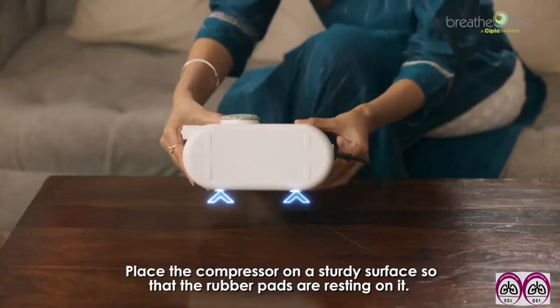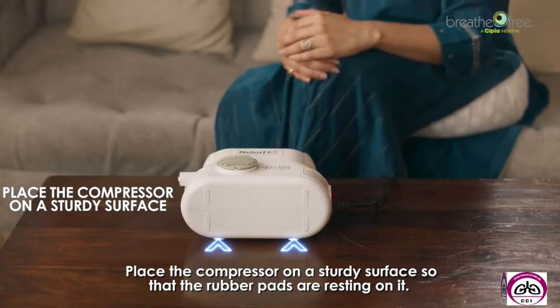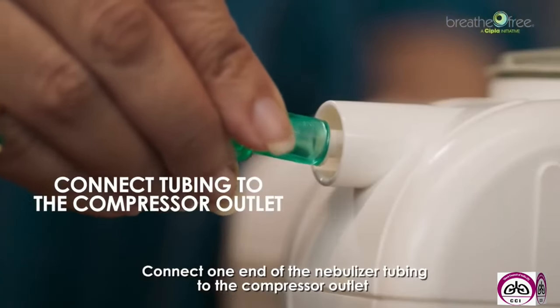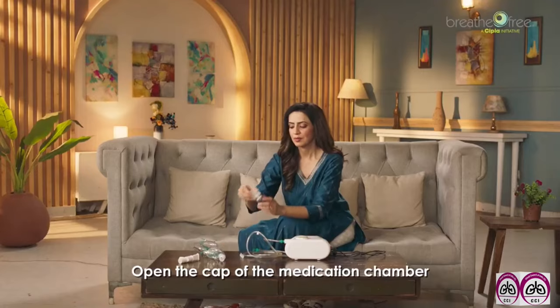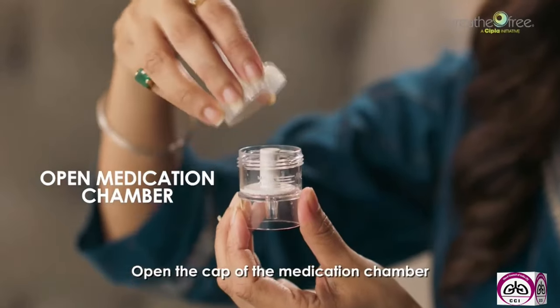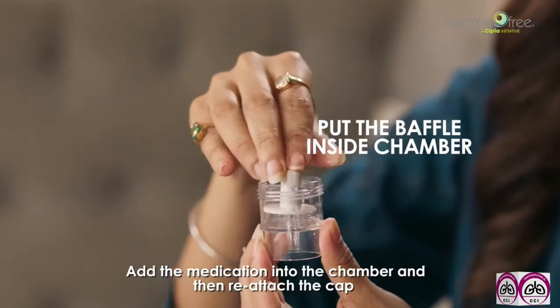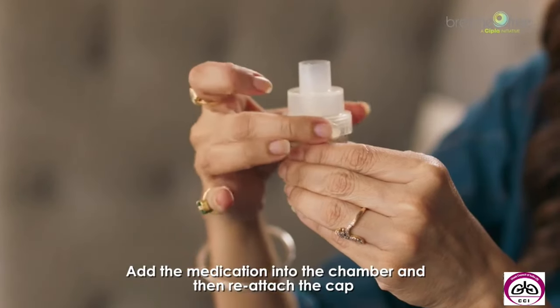Place the compressor on a sturdy surface so that the rubber pads are resting on it. Plug the power cord into the electric outlet. Connect one end of the nebulizer tubing to the compressor outlet. Open the cap of the medication chamber. There's a baffle inside the medication chamber. Add the medication into the chamber and then reattach the cap.